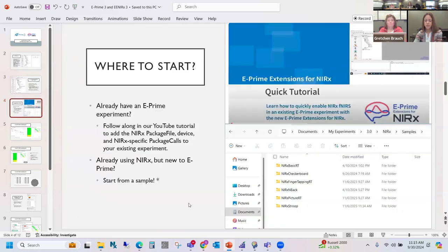So there are a couple places to start, depending on where you're coming from. If you already have an E-Prime experiment and you are looking to add NIRx to your lab, you can quickly follow along our YouTube tutorial on how to install the extension, add that package to that experiment, and add the specific package calls that will turn your already existing E-Prime experiment into a NIRx-enabled experiment. The video is less than 10 minutes, highly recommended.